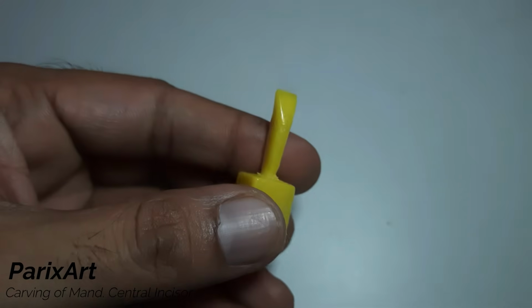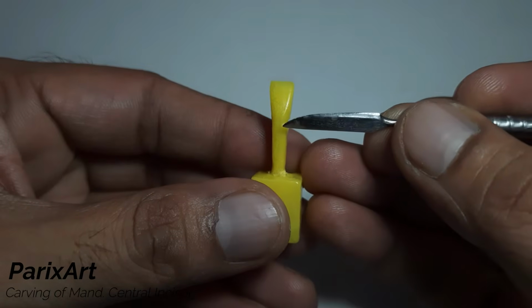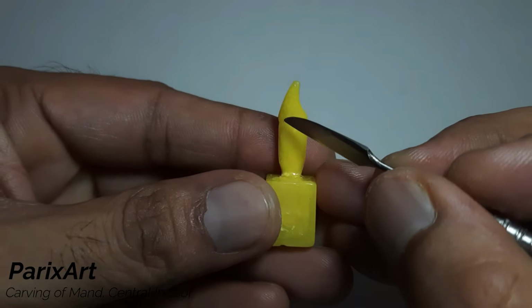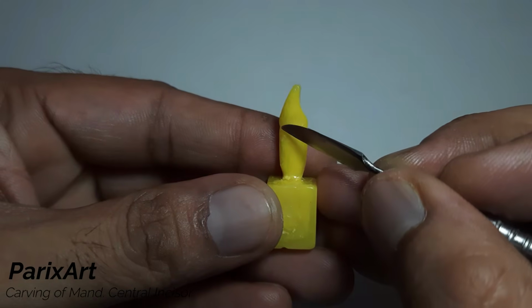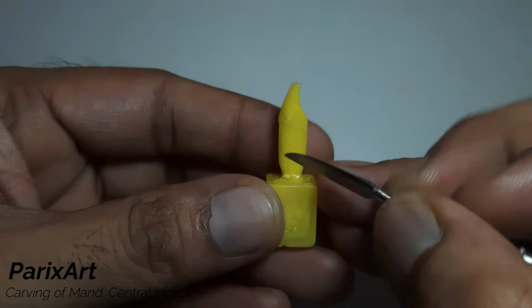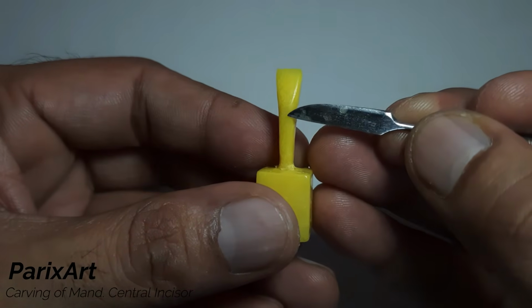Start carving at the cervical. You can see here at the cervical, it's convex. It's coming like this. It should have been coming in plane from the cervical line. So carve in a straight plane from the cervical line.